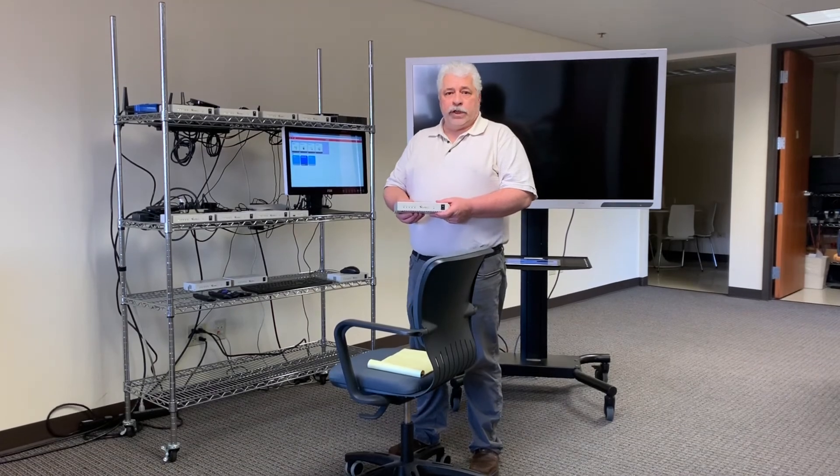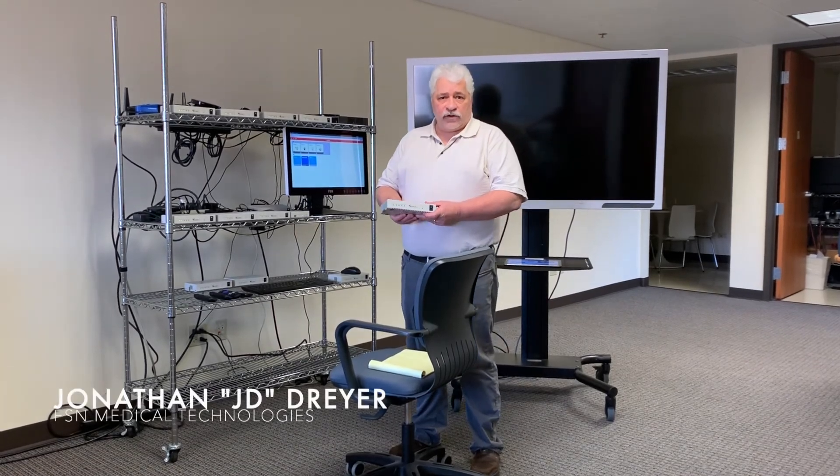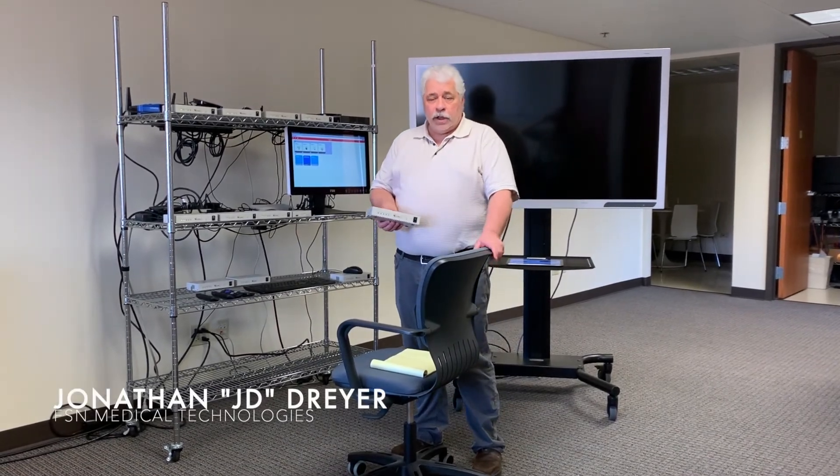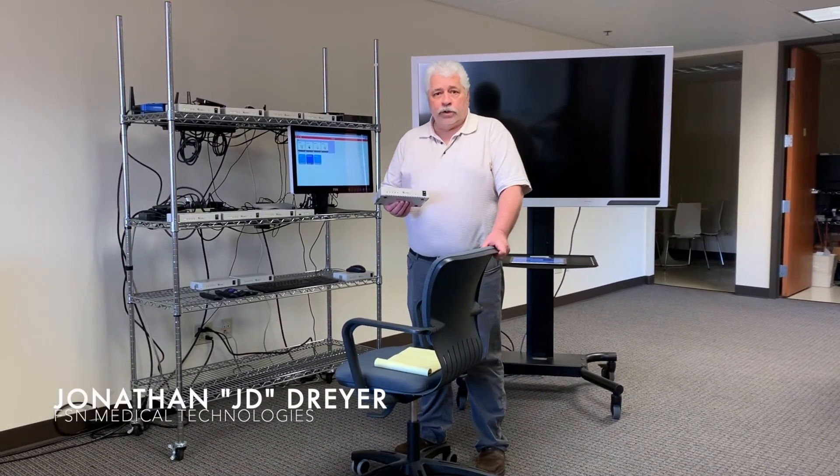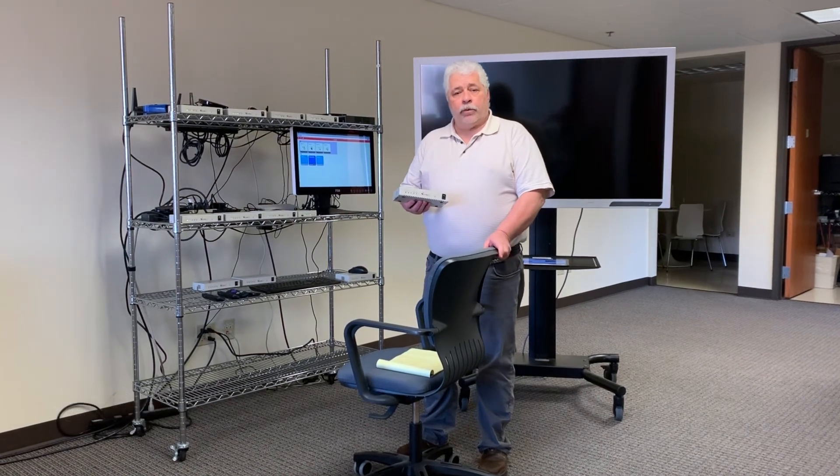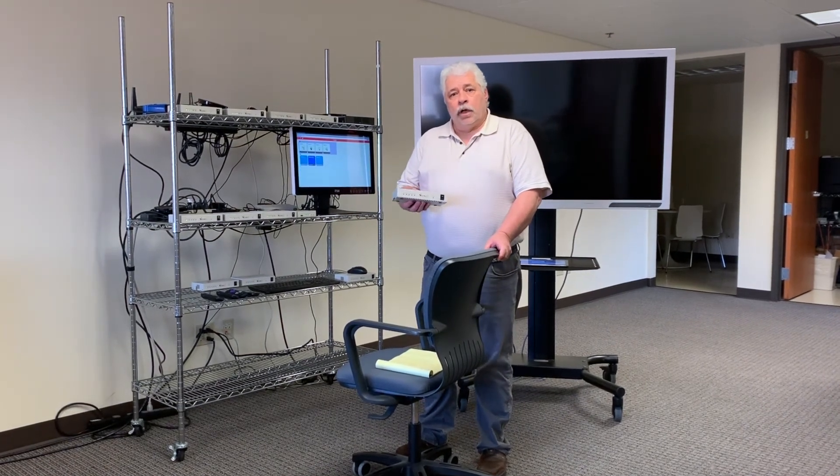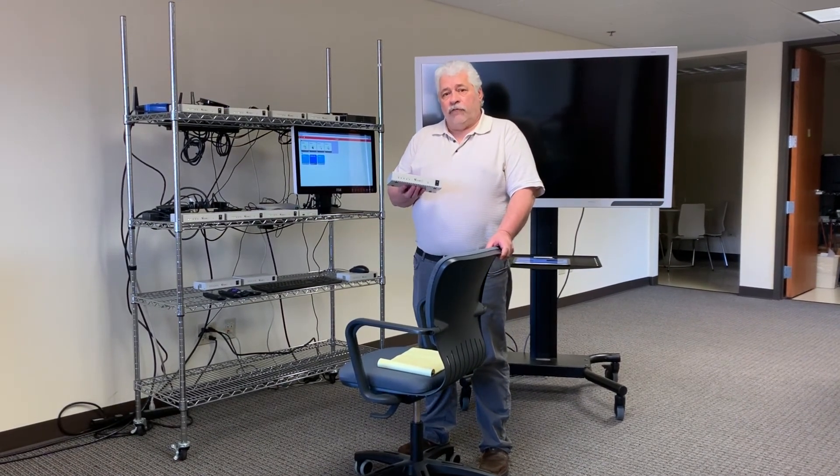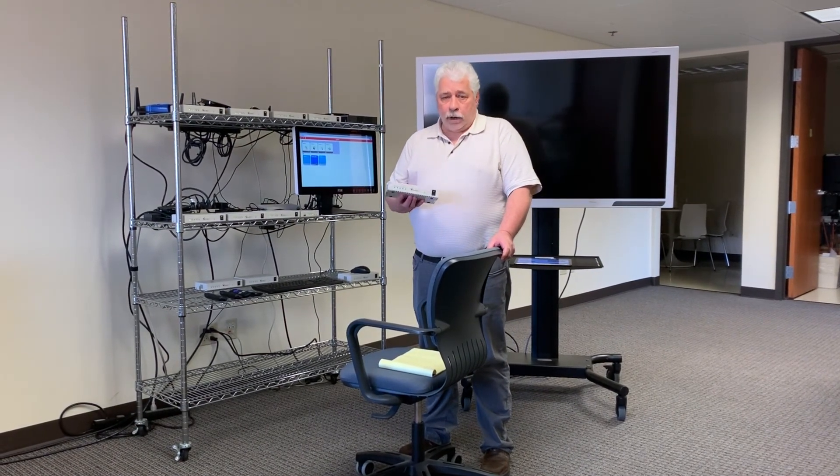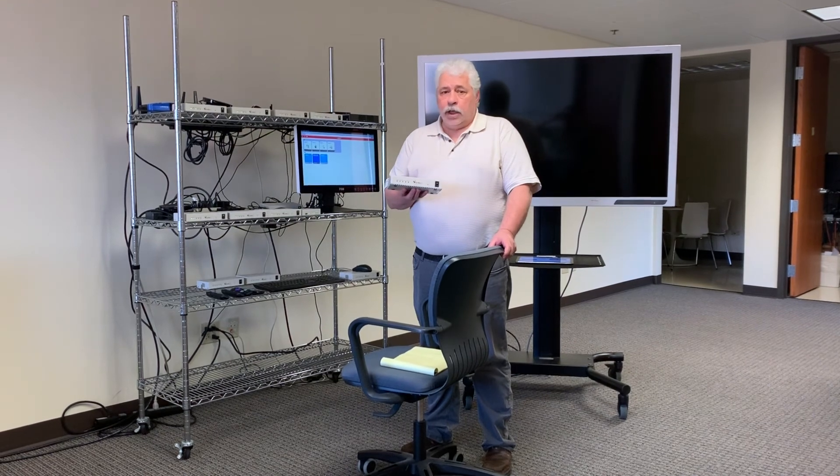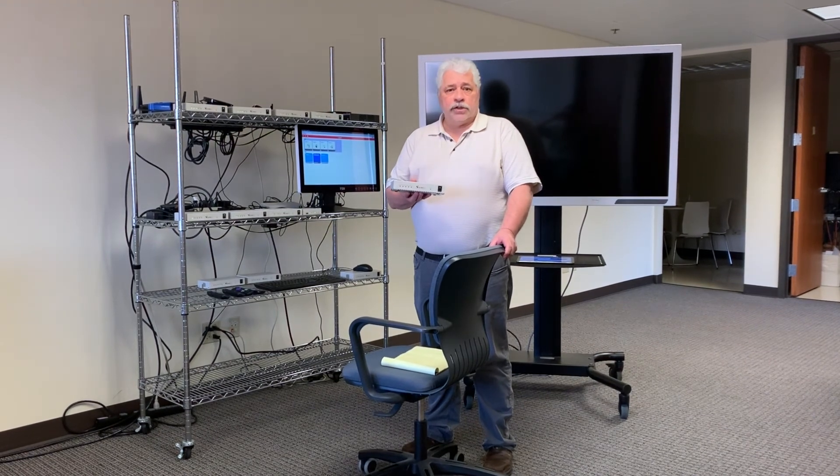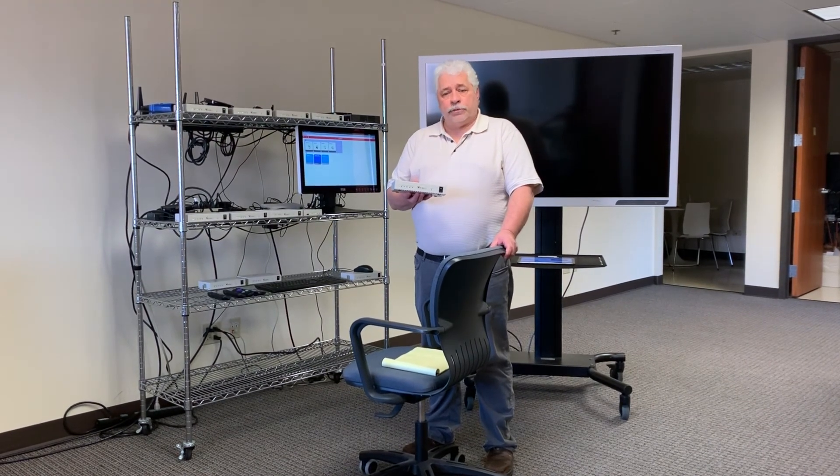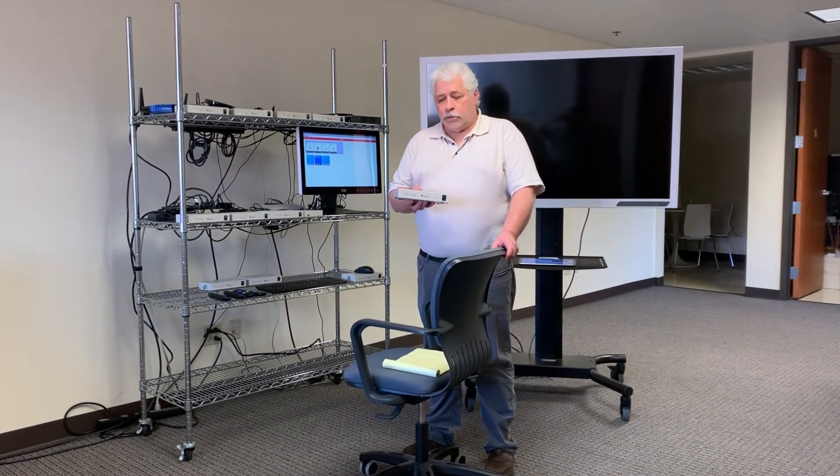Hi, my name is JD with FSN Medical. Today we're going to show you the operation of FSN's video over IP integration system for hospital operating rooms.